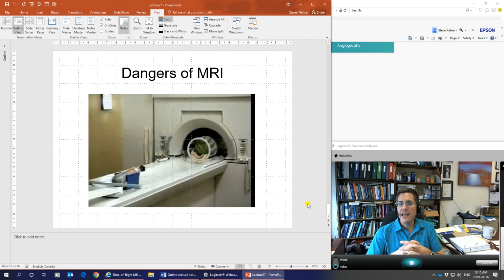Well, when you're laying in an MR machine, you're not moving, are you? Is anything moving in your body? Yeah, your blood is. Your blood is flowing with velocity V. Is your blood charged? Yes, it is, because your blood carries all these ions. When you drink Gatorade, when you're depleted, you're drinking it to get these electrolytically charged things, calcium ions, magnesium ions, sodium ions, back into your body. So your blood is carrying charged ions.